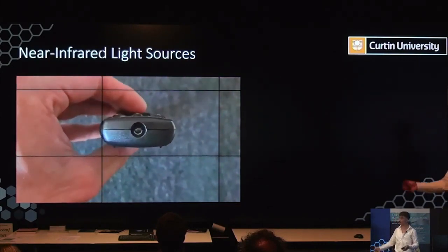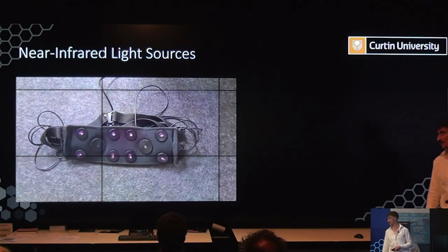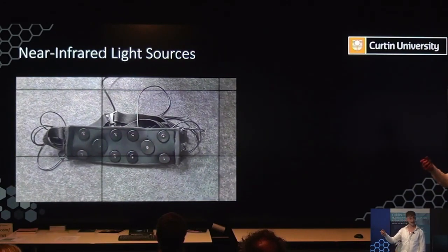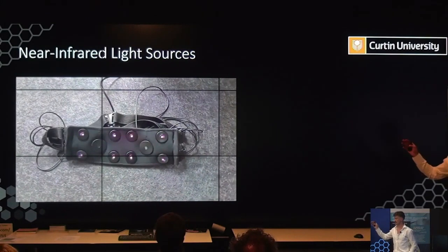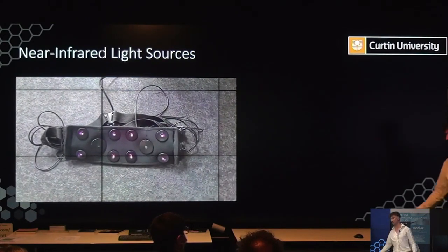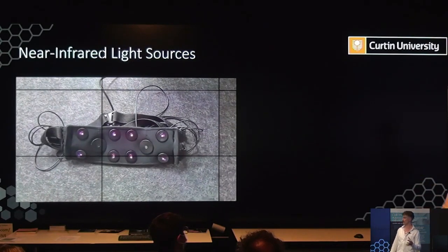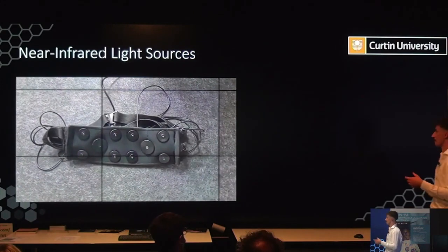Now that's the same thing as the LEDs on our headband. So there's 8 LEDs, and you can see when we start a recording, the lights light up. That's not something we can see with our eyes, but my phone does manage to capture near-infrared light. And the point of this is to illustrate that some of the technology that these use really is such a commonplace, ordinary thing. And we use it every day to do something as trivial as change the TV station.